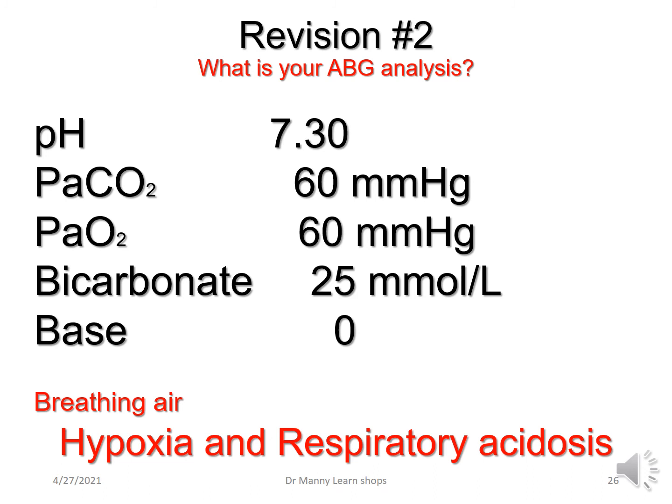They've got a respiratory acidosis, which means they're hypoventilating. Their PaCO₂ is 60, which is greater than 45, and their pH is acid, which is less than 7.35. Remember, the pH tells the story. pH says acidemia, acidosis. You've got to find the problem.